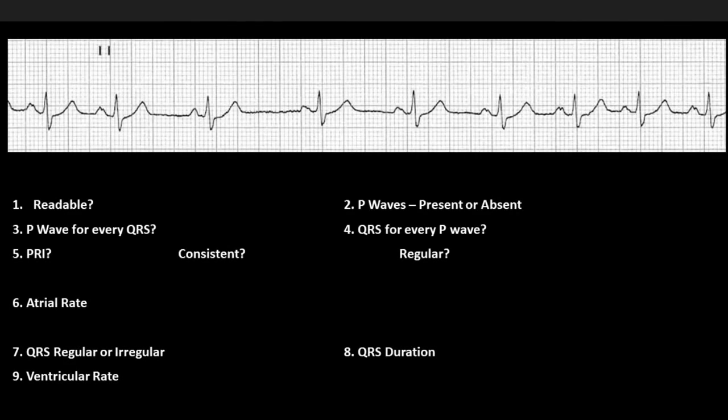Hey, how you doing? Today we are going to take a look at sinus arrhythmia. So if you had the ability to identify what a sinus rhythm is, and then take a look at what a sinus brady, sinus tach, all those wonderful things, you are not going to be disappointed in trying to interpret a sinus arrhythmia. So let's go ahead and get started.